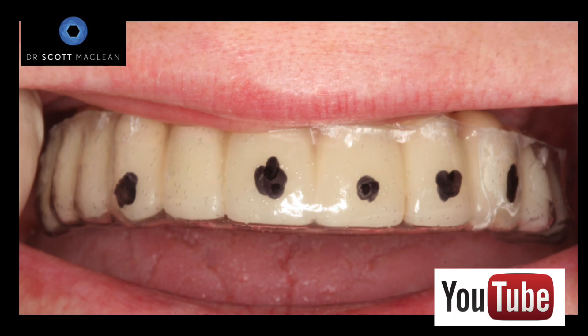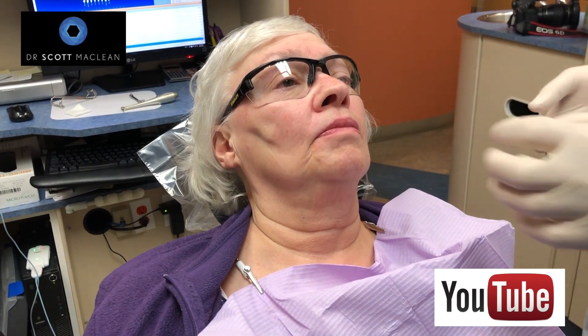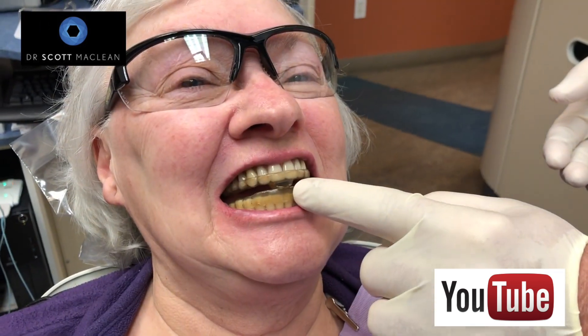For certain patients we would do all-in-four; other patients we would do this. The angle of the implants — which we showed in the presentation — was off on this case; they were done in another office. You were a little frustrated with that dentist? Yes. Terrible pain, couldn't clean them, bite was off, terrible jaw pain — it just didn't fit. This B splint is an insurance marker for me — making sure we're keeping the forces turned way down at nighttime, because she is a powerhouse and can bite very hard.